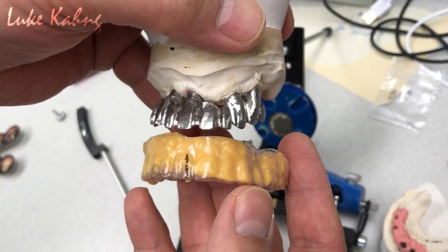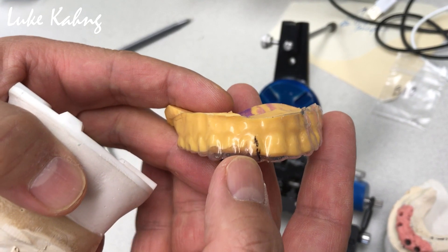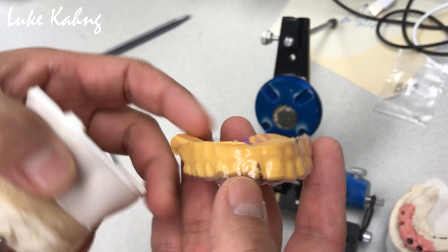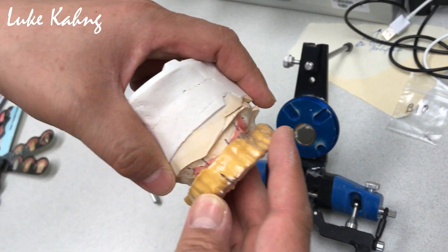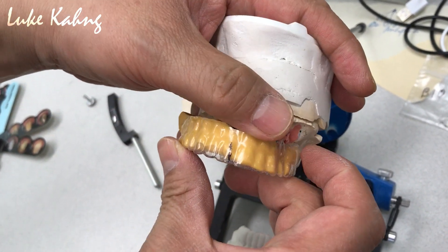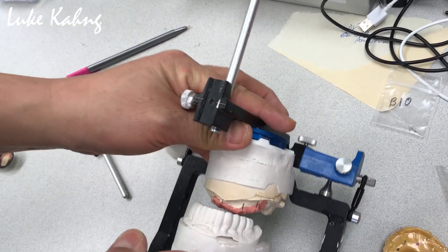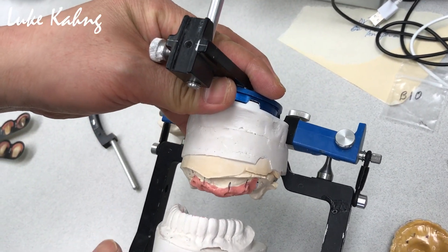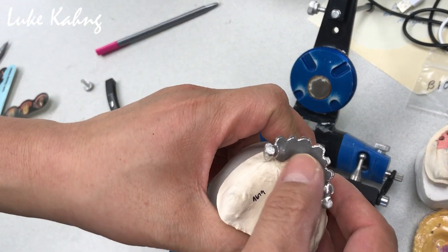Elvin finished a nice job. This is the template with Dr. Semi's midline indicator. So we made the metal try-in from here, which is class three. Now we've finally made all metal lingual.